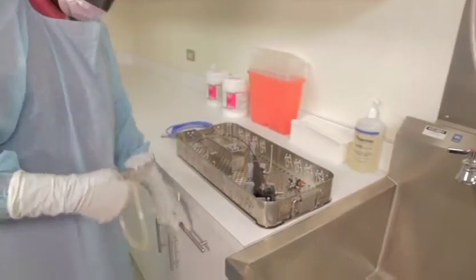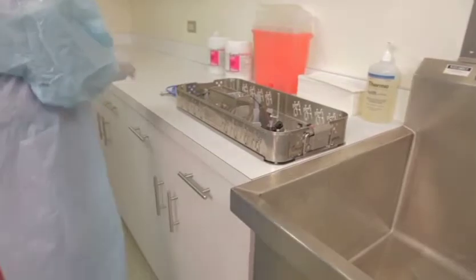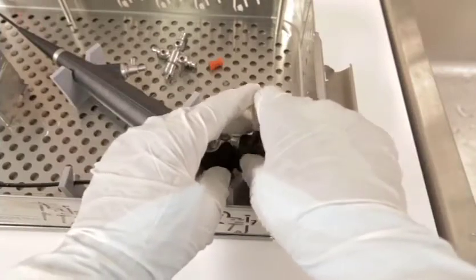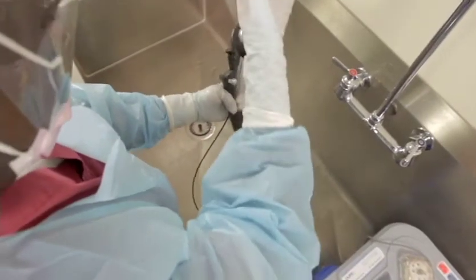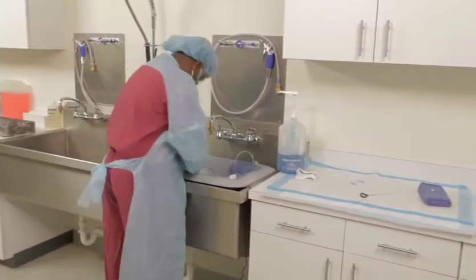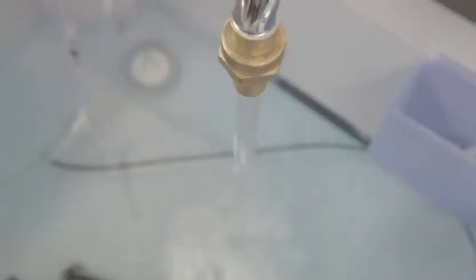You are now ready to manually clean the scope. The first step starts with disassembling the parts from the scope. Remove and soak the sealing caps, valves, and adapters in enzymatic detergent. Rinse off any gross debris or pre-cleaning products from the scope, then place the scope into a sink or basin with the correct dilution of enzymatic detergent and processed water.